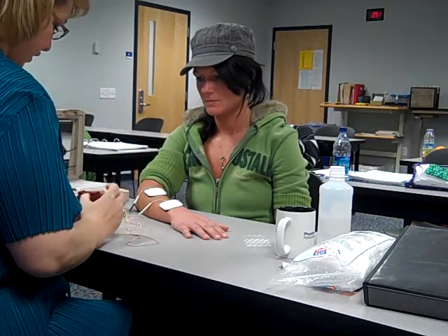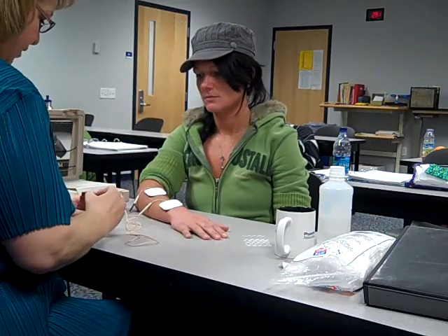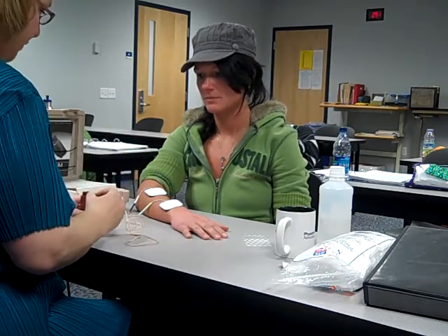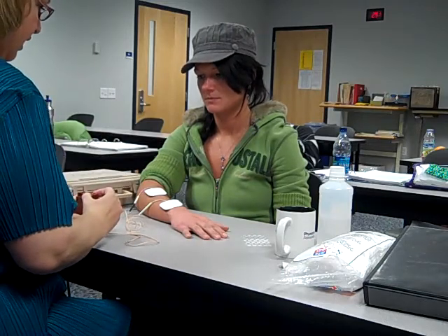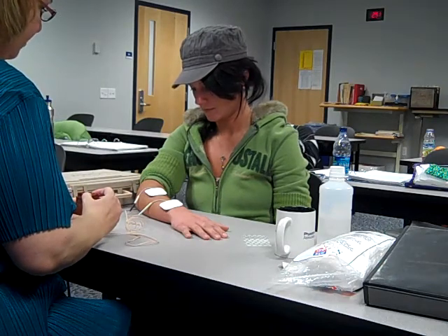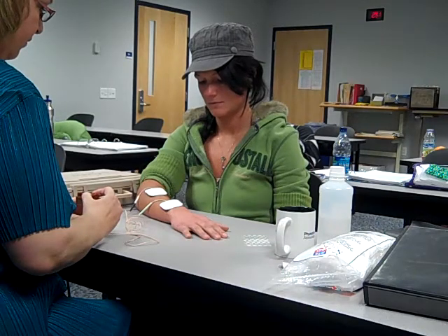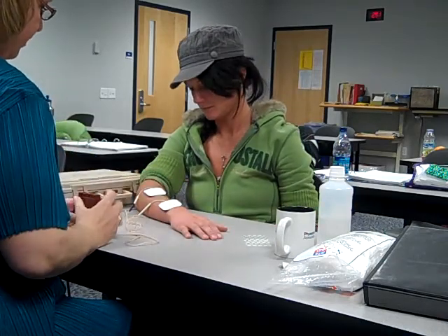We're going to start turning this up again. I want you to relax your hand — it's important that their hand is relaxed so that you can see when it starts twitching. Tell me when you first feel anything at all. I feel it. And you feel that tapping I was talking about? I'm going to try to get this so everybody can see. Now I'm going to turn this up until I see some twitching. Still comfortable? I'm seeing some twitching here — there's some right back there and some up there too, so we're seeing twitching here and there.